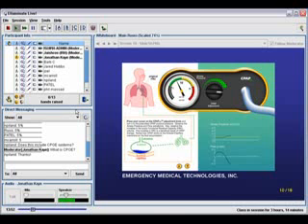Okay. Essentially, this company has a CPAP device, a pre-hospital device for paramedics to give CPAP in the ambulance. They wanted a way to send out an in-service without sending out the equipment, allowing someone to really try out the device and understand what it's for before the company went out and did the full in-service or actually sent the real machines out.